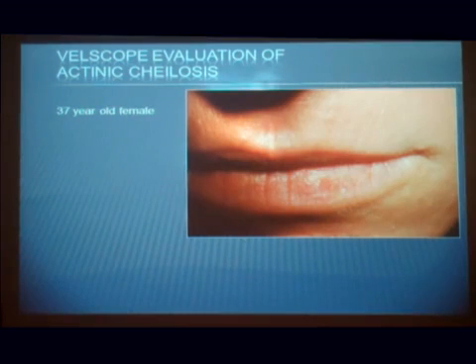The surgeon called her actually, well, she never showed up. It was moderate dysplasia. She never showed up, so we got 20 dentists sitting around in the dental school wondering what to do. And I said, well, why don't you just look at each other? And everybody was negative. We had some really pretty pink and orange colors from the bacteria on our tongue, but otherwise we were negative, except this 37-year-old gal who was the salesperson.